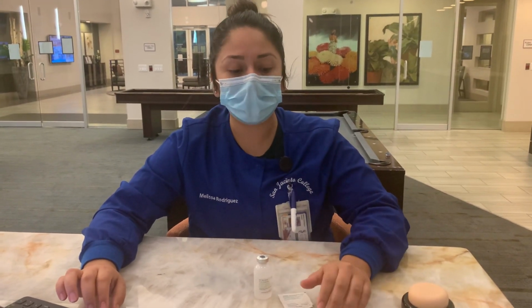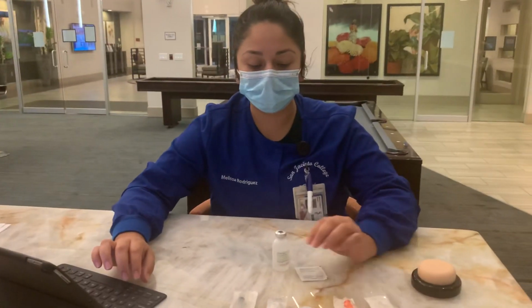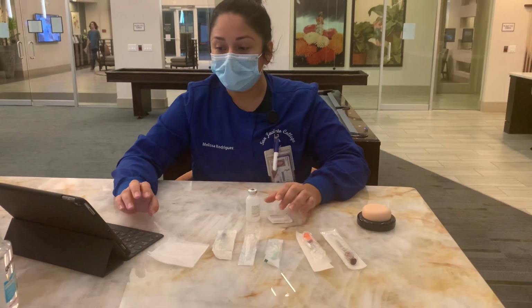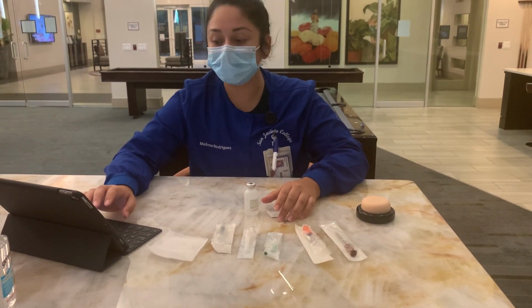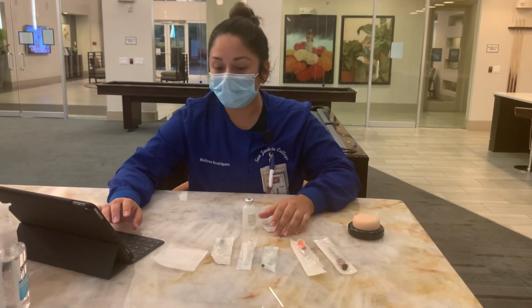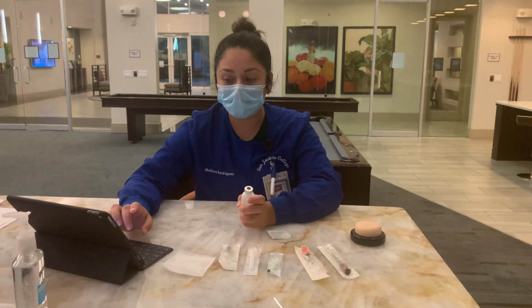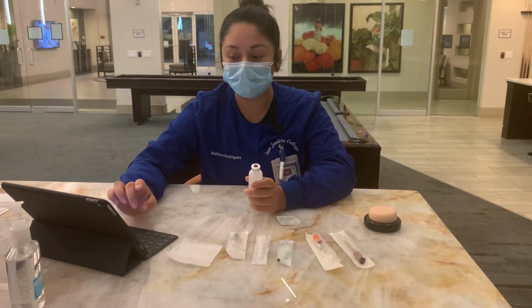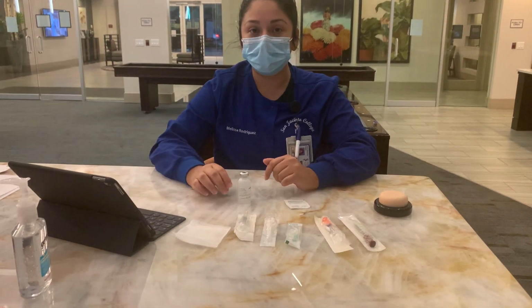So I'm gonna go ahead and gather all my equipment, my appropriate syringes, needles, my vial, my alcohol swab, and my gauze. I'm also gonna take a look at my patient's history. Before I go to the patient room, I'm gonna verify every medication on the monitor and verify the expiration date on every single one of them. Now that I've done that, I'm gonna take my equipment with me into the room.